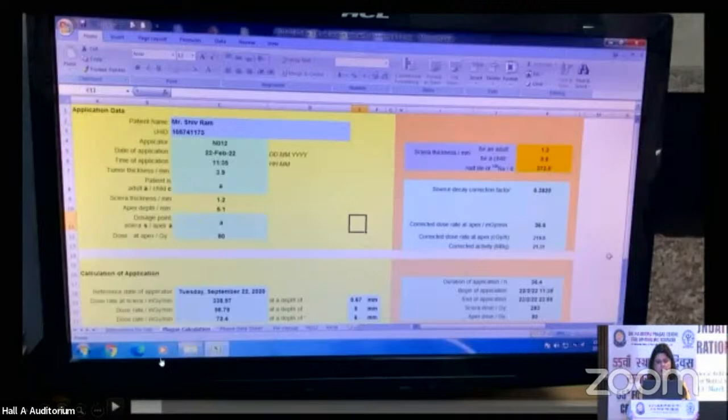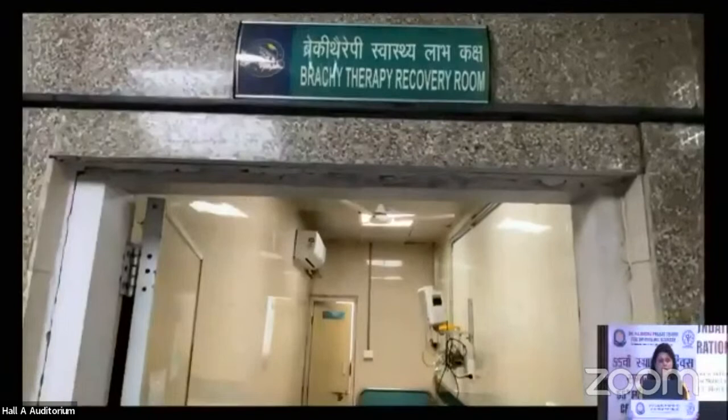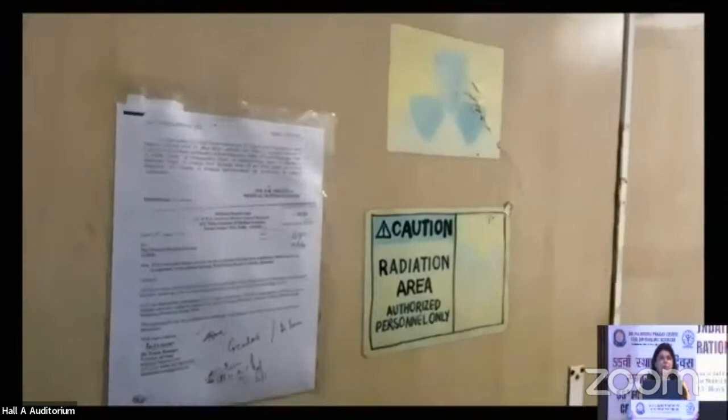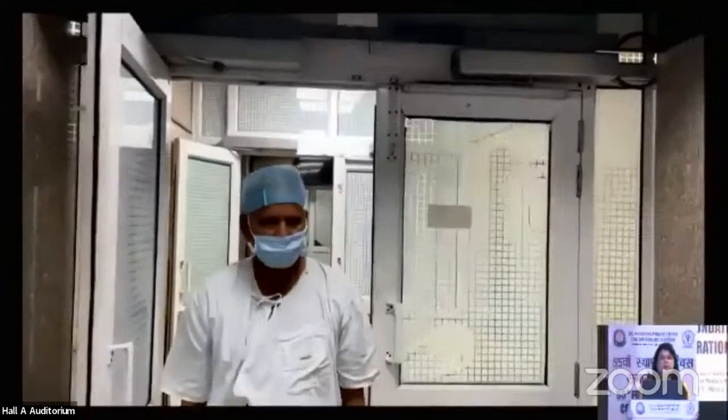Now, moving on to the actual steps of the surgery. So here you can see in the OT where the autoclave is kept and the plaques are autoclaved. Now, this is what I was talking about, the isolation room. There's a separate room that has been made, keeping in mind all the radiation safety precautions that we need to take. And before the surgery, we confirm which eye has to be operated. And then the patient comes into the OT for the actual surgery.